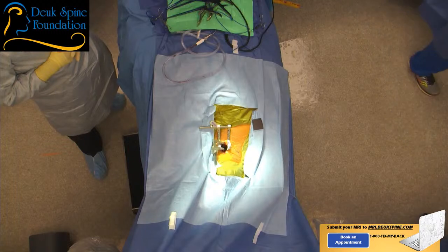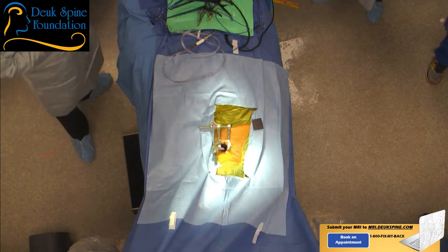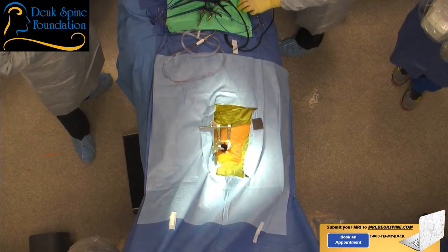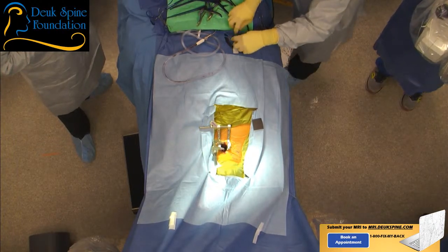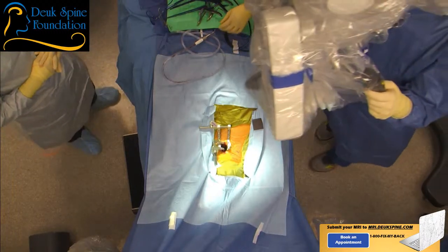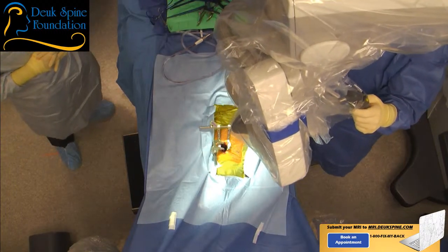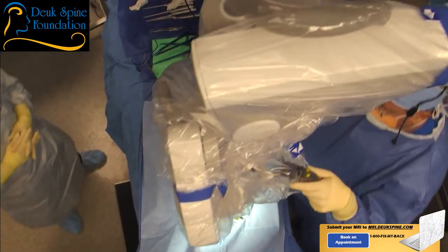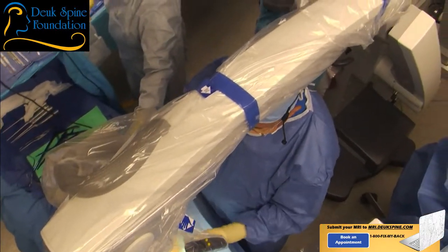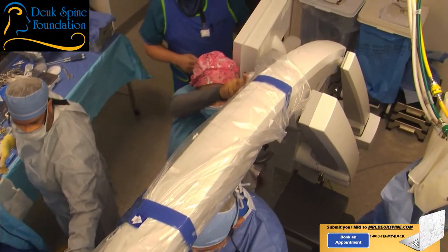Yep. Now the microscope has two eye ports or two heads. One is for the surgeon, one's for the assistant. Help him. Don't hit the IV stand. Come around and in. You guys want the base right in here. All right, so we're bringing this, watch this drape here. Grab that and pull it away from me. Yep. I need the light on the scope. So I'm directing my team to bring in the operating microscope. And we're gonna have it in position in just a minute.